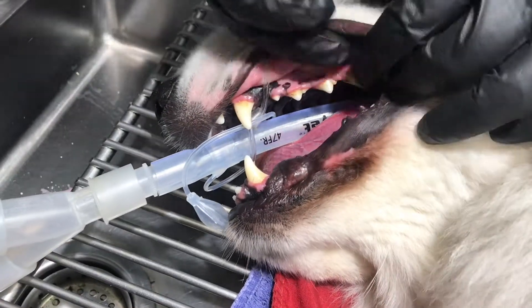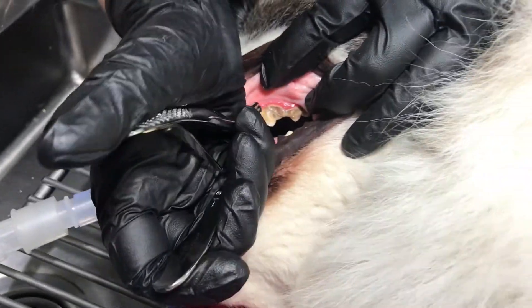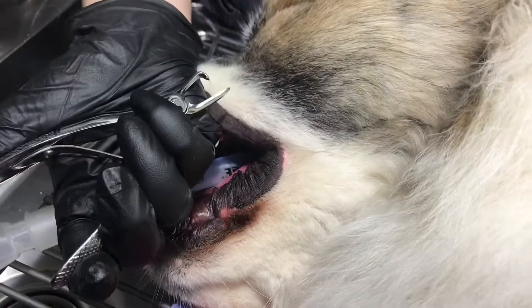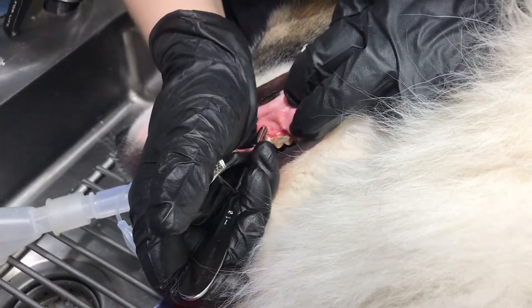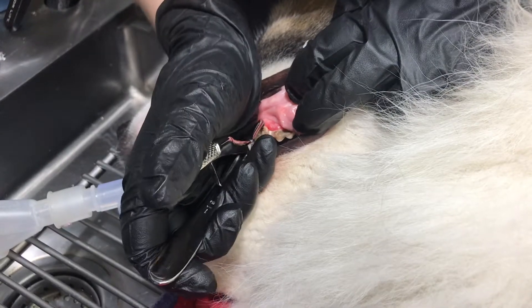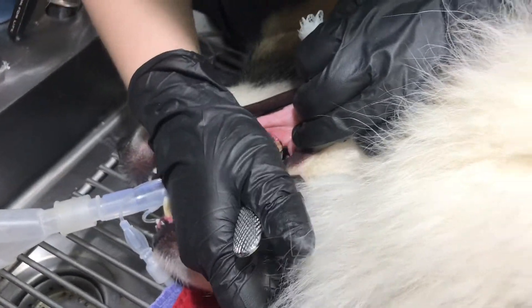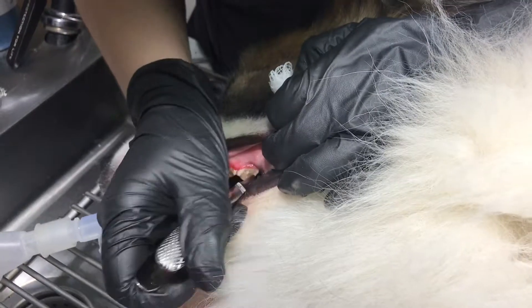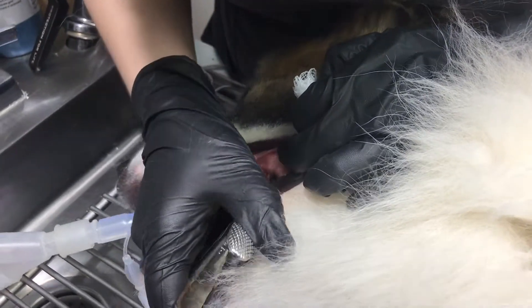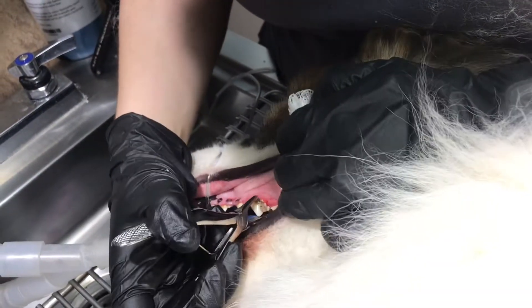Once we get to scaling, Sarah's using an instrument called a Hockville tartar forcep. She's going to break these big chunks of plaque off physically. It increases the speed at which we can do these procedures. If we use a dental scaler or try to hand scale that, it would take us hours to get this stuff off. So these forceps are specifically designed to break large chunks of tartar off quickly and give us a good jump on the procedure.